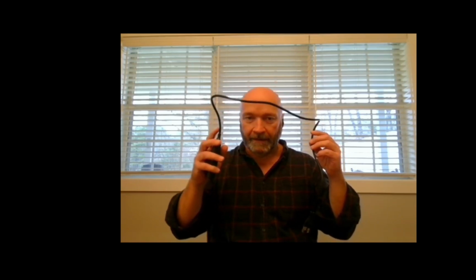Now I'm going to use this charger cable to hopefully show you what it is that we're looking for on the obliques. And if you watch the anatomy video, you know that the colon doesn't just come up the ascending side, make a turn to go from the hepatic flexure across to the splenic flexure and then down into the descending colon. It makes 2 turns really. It turns from the hepatic flexure to go across the patient's abdomen, yes, but it also changes from posterior to anterior. So your transverse colon is more anterior than the rest of your colon.